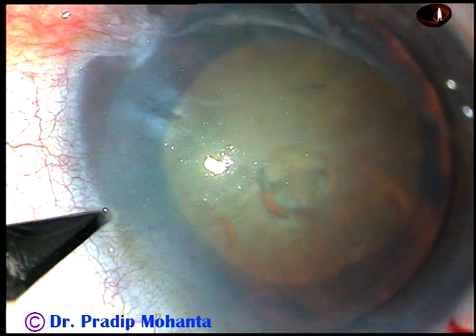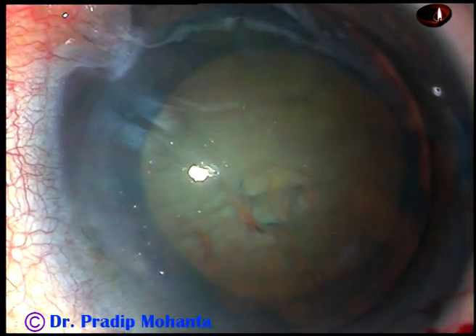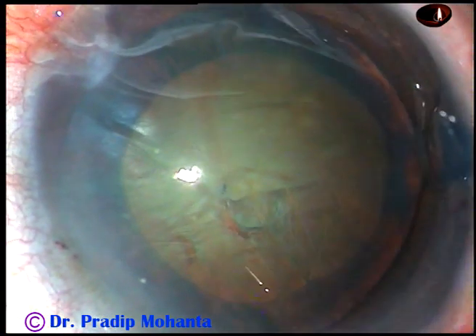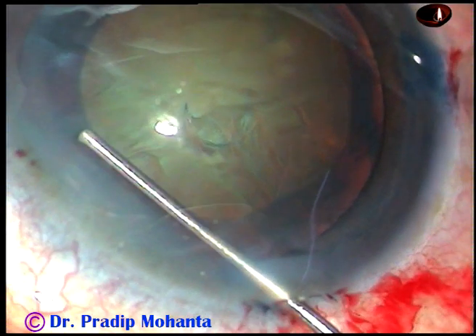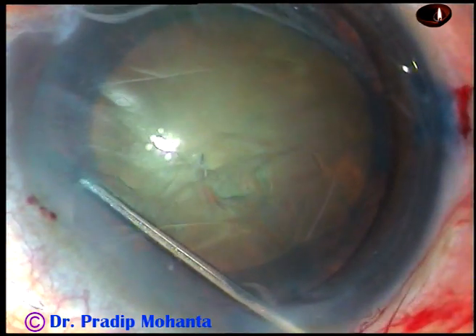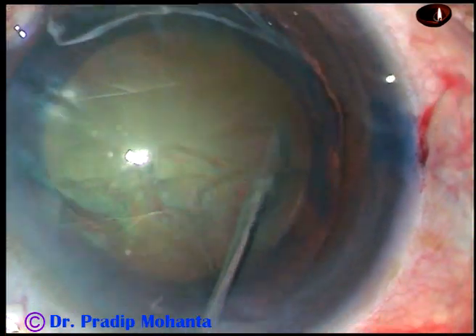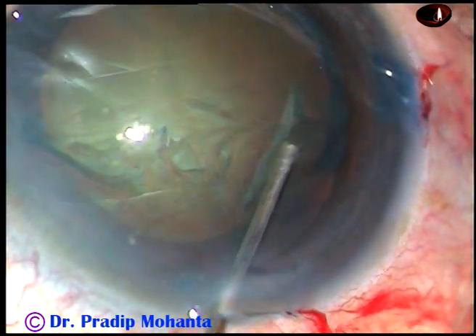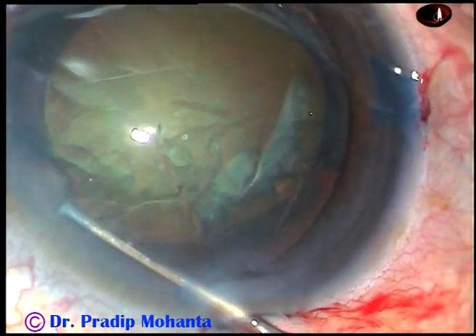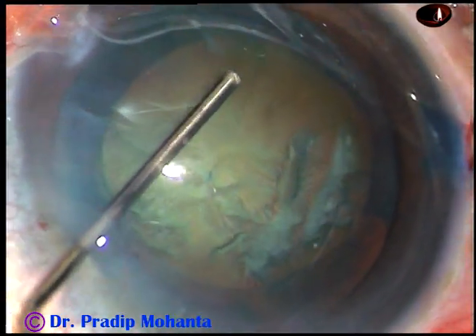Over 3 to 4 months this rhexis will contract and become a little smaller, so it is better to do a rhexis of 5.5 to 6 millimeters. Now there is another paracentesis on the left side of the main incision. Now hydrodissection — a very important step. Take Ringer's lactate or BSS, go underneath the anterior capsular rim, go near the equator and inject very gently a wave of fluid. You should see the fluid going towards the opposite equator. As it reaches the opposite equator, tap right over there and see the fluid come along the equator anteriorly. Then you can do some more hydro at additional points and tap the nucleus to try to rotate it.